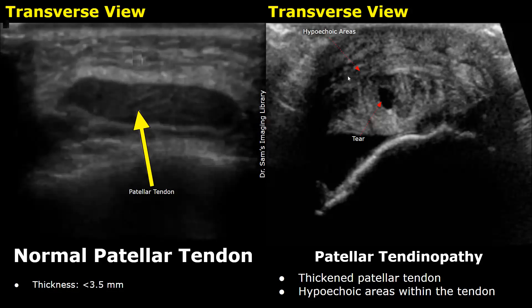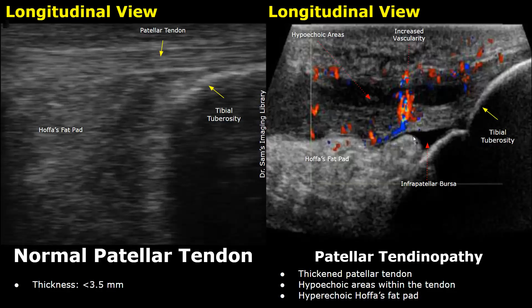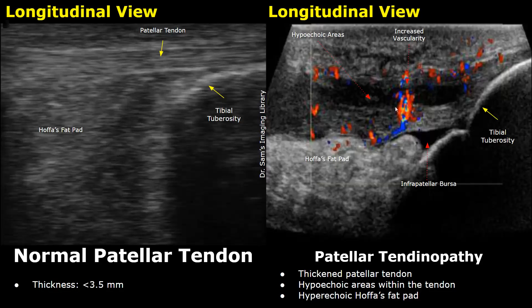The tendon is filled with hypoechoic areas as well as an anechoic area representing a tear. On color Doppler, increased Doppler signals will be found within the tendon in patellar tendinopathy, indicating increased vascularity due to inflammation. The tendon is thickened and has tears and hypoechoic areas. The Hofas fat pad is significantly hyperechoic and there is a significant amount of fluid accumulation in the infrapatellar bursa.